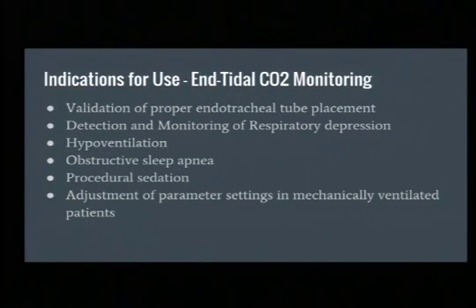So indications for use of end-tidal CO2 monitoring: to validate proper tube placement after endotracheal intubation, detection and monitoring for respiratory depression, hypoventilation, obstructive sleep apneic patients, procedural sedation like I talked about in the ER, and adjustments in your parameter settings in vented patients. We have a whole event lecture we'll go through later.